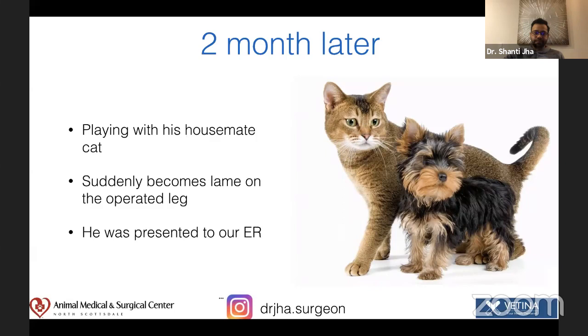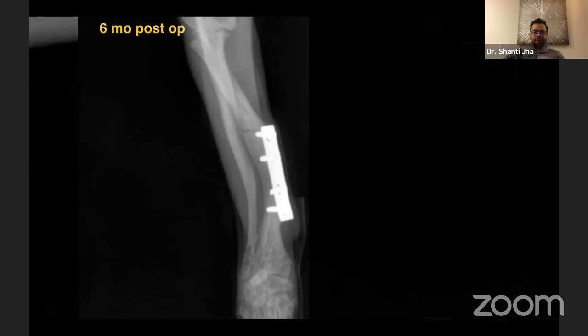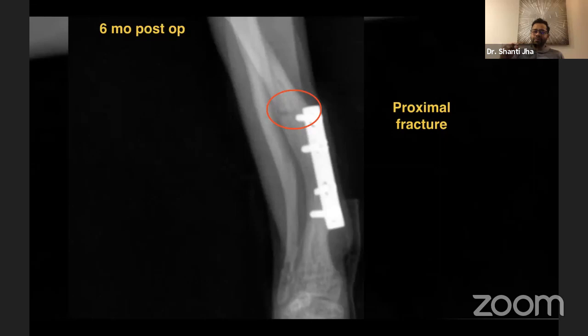So here is a fracture. I mean, let's look at this fracture for a few seconds. I'm just going to zoom in. So you can see that there is a small amount of almost non-displaced greenstick kind of proximal fracture right there.